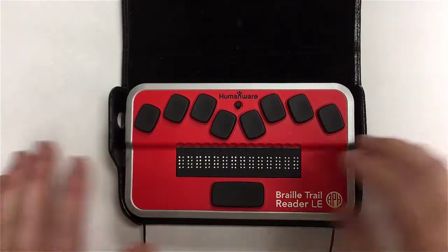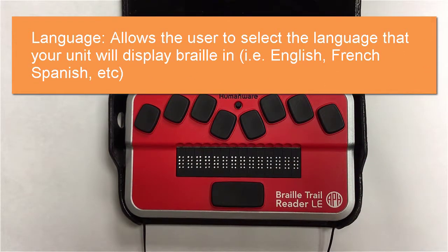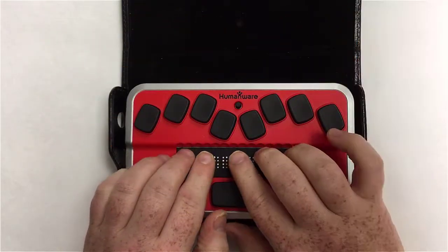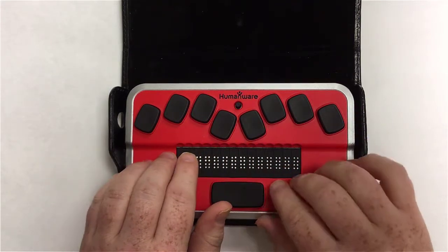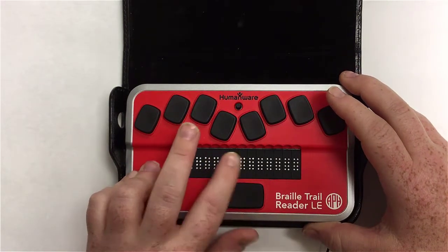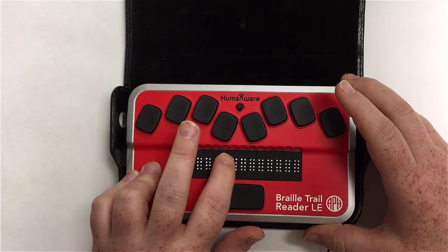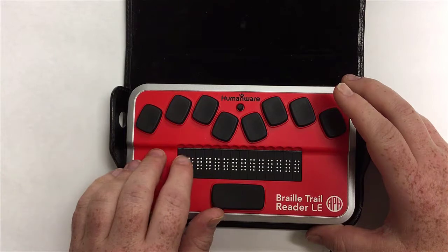The next menu item is language, which allows you to select the language your unit will display Braille in. Entering it, there's a full cell next to English. If you wanted a different language — say, you're learning French — you could navigate through the options. We're going to backspace out because we won't change that.